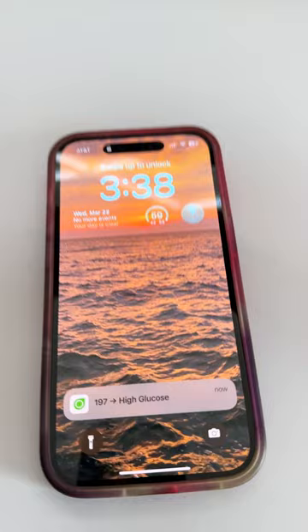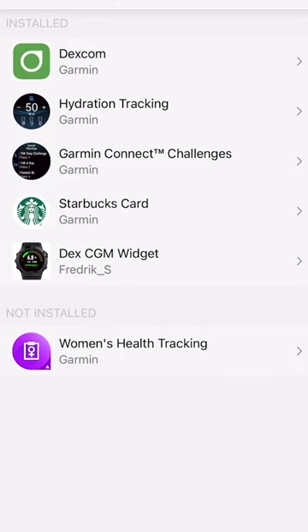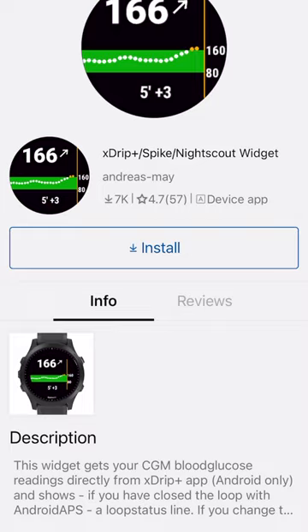Because the watch connects directly to a Dexcom account, you can follow someone else's numbers. For Freestyle Libre users, there's a way to use NightScout.